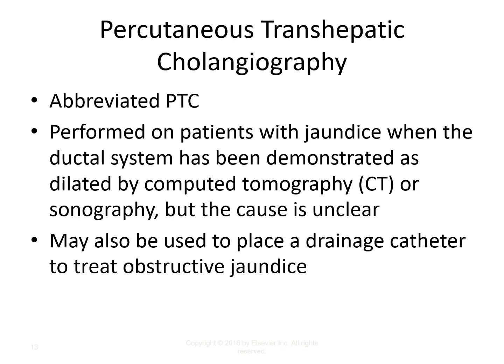Transhepatic means across the liver. Cholangiography means recording of the angiographic vessels, the vessels pertaining to the biliary system. So stick a needle through the patient's skin, across the liver, and access the biliary system, and then inject contrast and take pictures. It's pretty straightforward.